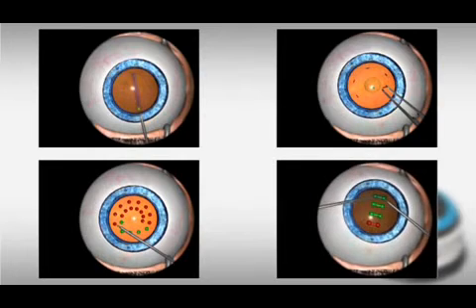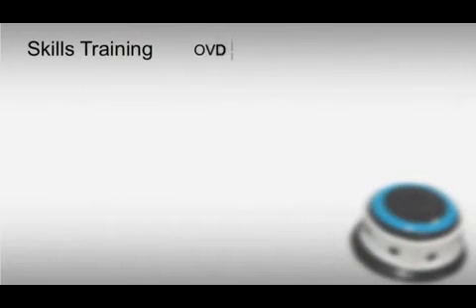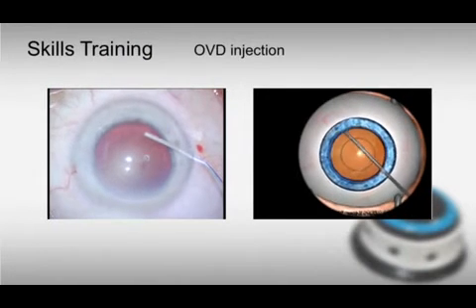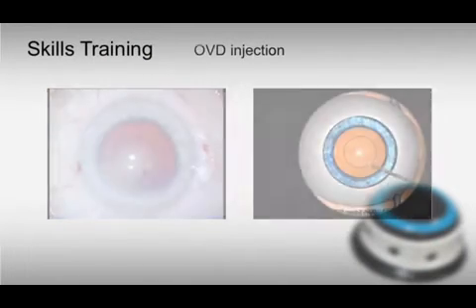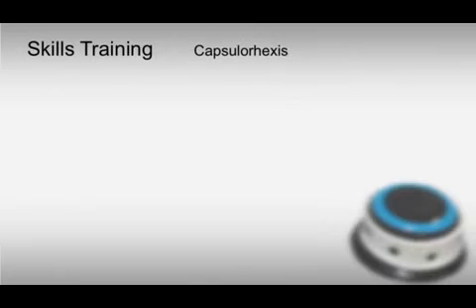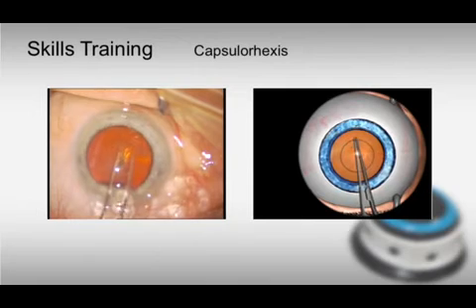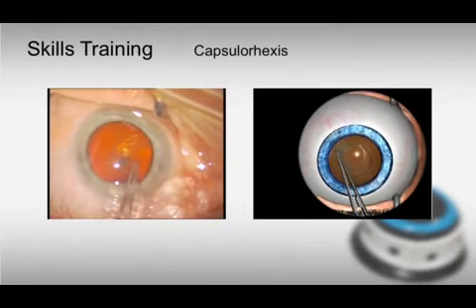Afterwards, different steps of a cataract surgery can be performed. First, OVD injection. Capsulorhexis. Please compare the real situation versus the virtual simulation.